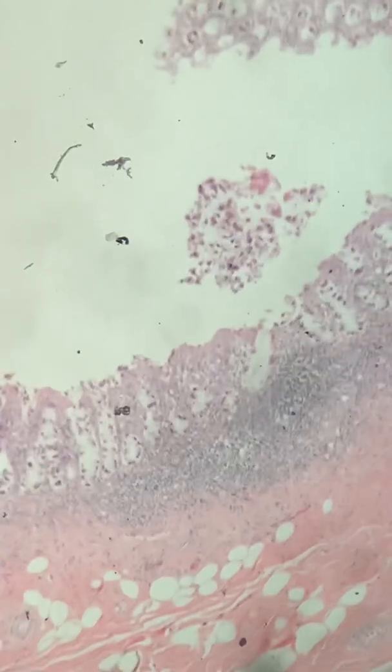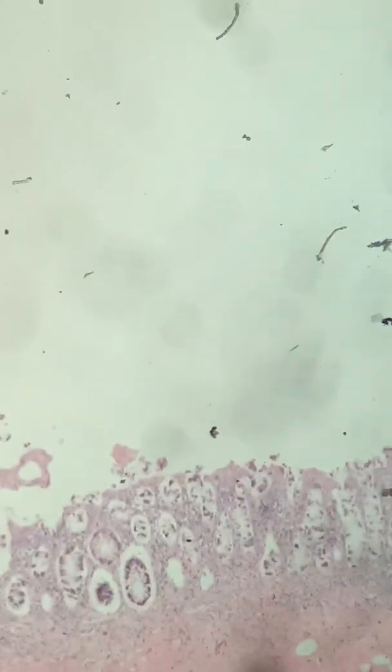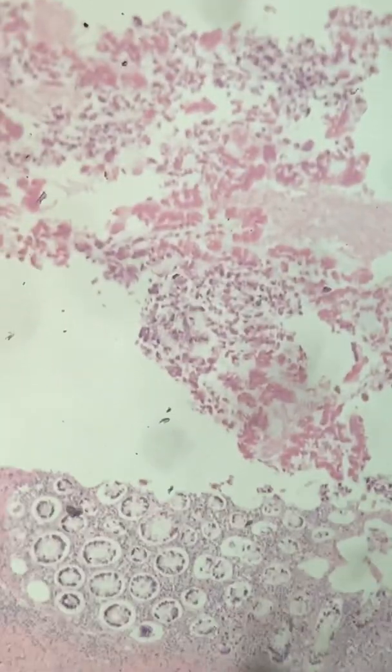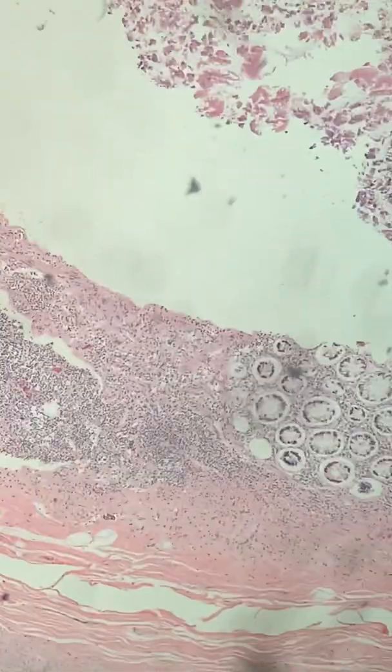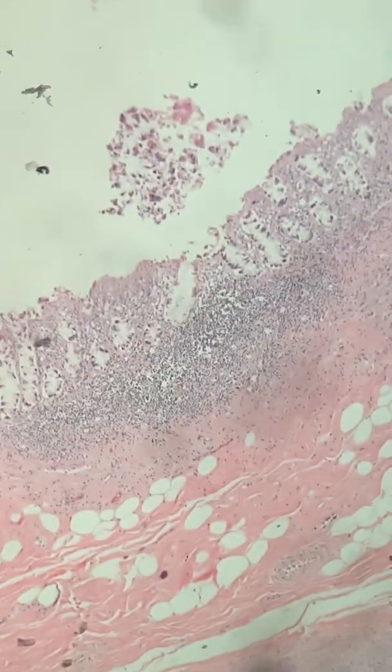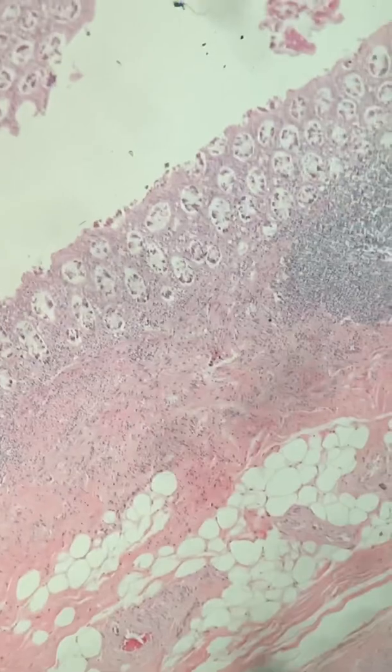Not much in the way of appendicitis. But it seemed to me, in my opinion, that there is a reduction in the lymphoid tissue. Okay, again, that correlates with the pathology of COVID-19. You should see a little more exuberant lymphoid response in a person infected with COVID, a viral infection. Okay, we're getting a little more into it now. This would be almost normal looking appendix here. And this is a relatively middle-aged man, so older, so you're not going to have a lot of activity within the appendix. As we get older, the appendix becomes almost fibrotic-like. Okay?